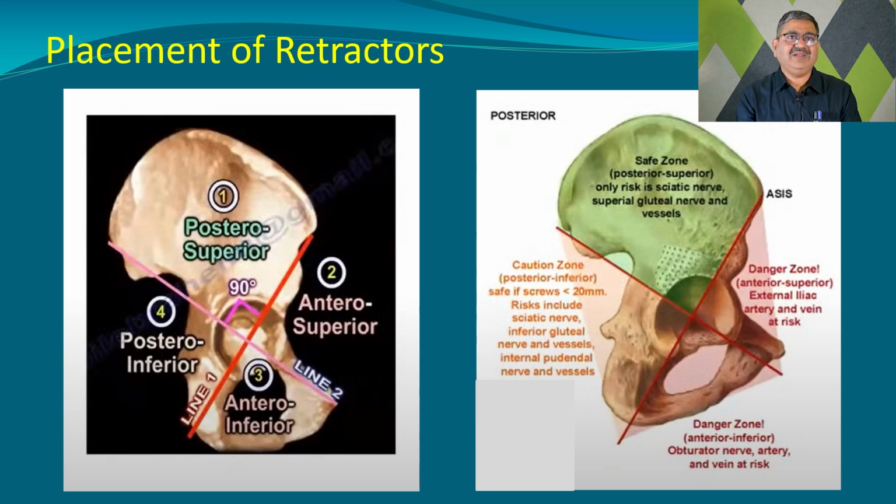These are the placements of the retractors. These are the zones which show the safe zone and dangerous zone, or zones with caution, for placement of the retractors.